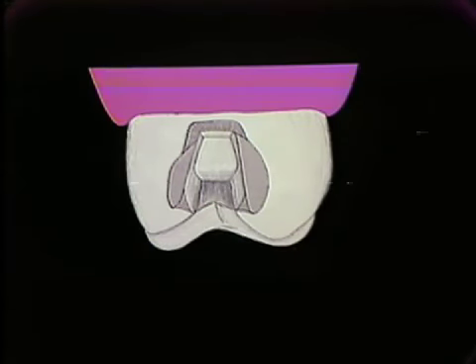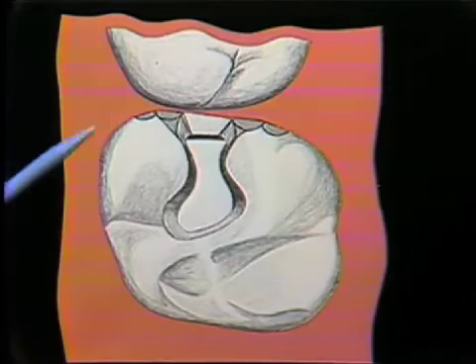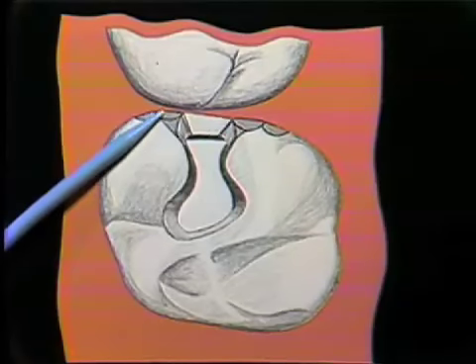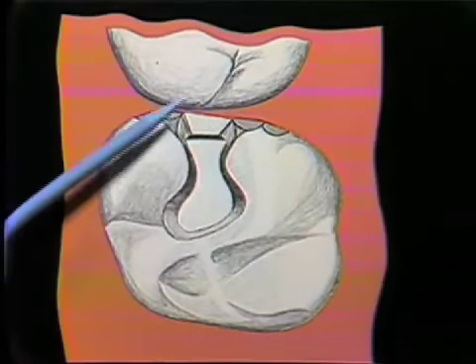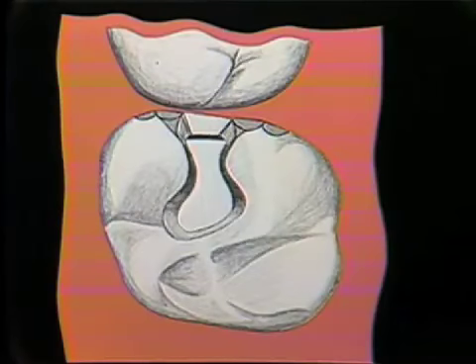As we now go to the third type of slice, which is the auxiliary slice, you will note that we actually show here 4 areas of slicing: 2 on the buccal, 2 on the lingual. This auxiliary slice is utilized if the carious lesion has necessitated gross removal of tooth structure from under the cusps, and yet not enough tooth structure has to be removed to warrant a full protective cusp restoration. The unsupported enamel may be under either buccal or lingual cusps, or both.